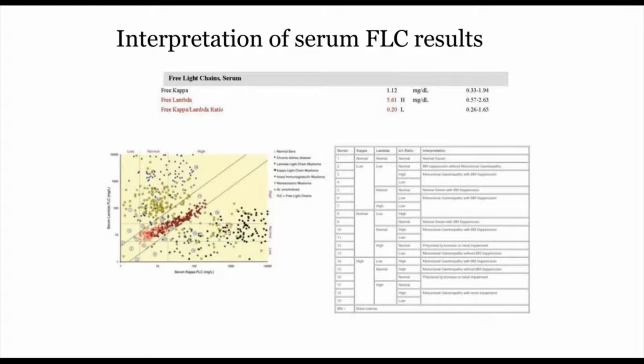The serum free light chain assay also has the interesting characteristic of not only quantitating free kappa and free lambda light chains in serum, but also being able to identify the presence of a monoclonal gammopathy simply by the ratio of the kappa to lambda free light chains. It has been demonstrated thoroughly in large clinical studies that most healthy individuals have a kappa to lambda ratio of 0.26 to 1.65. It has also been shown that people whose kappa to lambda ratio fall outside the 0.26 to 1.65 range either have a monoclonal gammopathy or multiple myeloma.